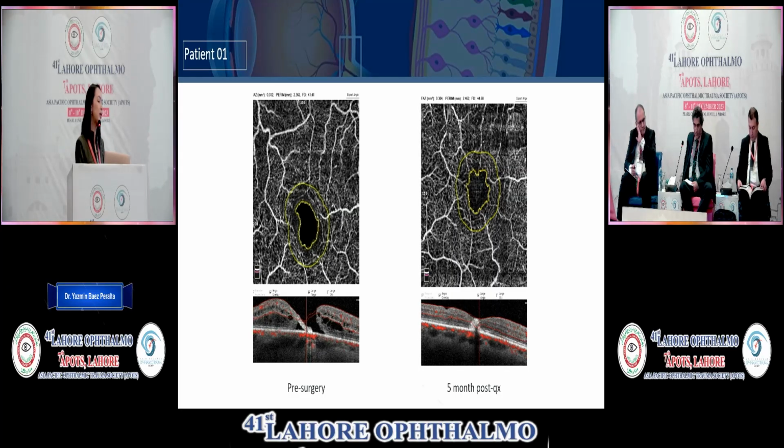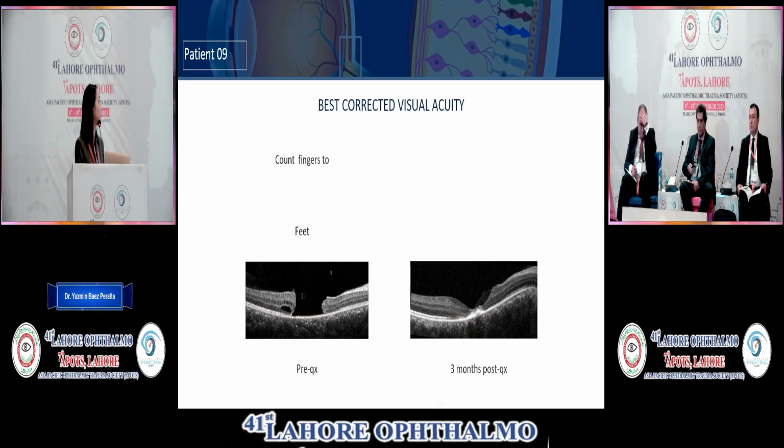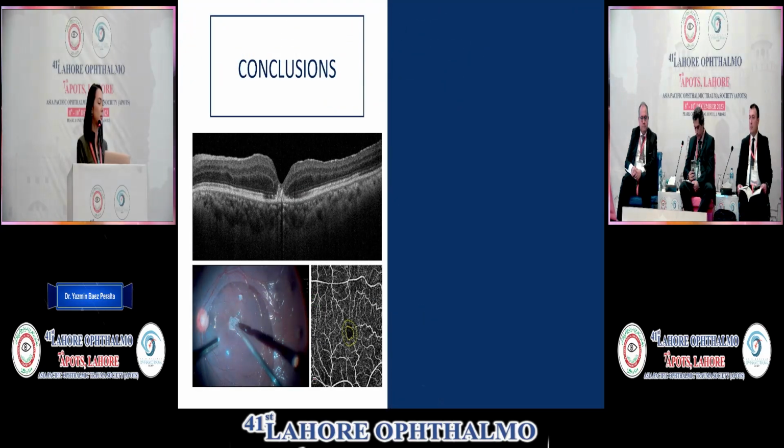And another thing that we notice in those cases is the avascular zone gets more regular, and the density of the vascular in the foveal zone grows. Here is one of our traumatic cases, a young patient too, and the vision improved very well too.